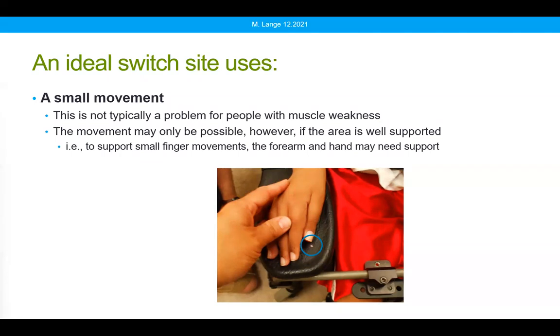The challenge with latch is that if the client is distracted or is going to have difficulty reaching the switch again, they can't stop themselves. The chair is going to keep moving. Latch is primarily used with people who use sip and puff, because to move forward, you have to exert a certain amount of air pressure within your mouth, and it's very difficult to sustain that for a long distance, like going all the way down a long hallway or down a sidewalk. So instead, you give one hard puff, activate latch, and keep going until you give a sip, which will then stop movement of the chair.